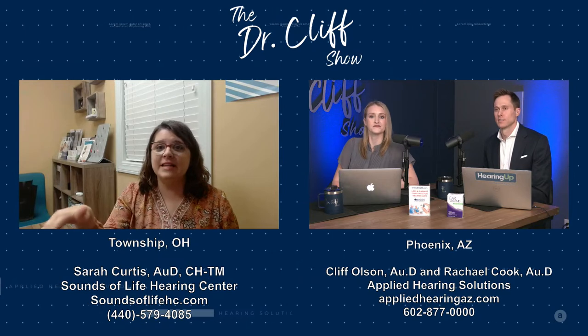But I also counseled him, this is going to be loud and annoying, and you are welcome to curse me under your breath or fully out loud when you go home, but I am not doing my job if I make you comfortable. Rehabilitation means you're uncomfortable on day one. You may be uncomfortable after week 2, but 6 months from now, you're going to call me crying for a loaner if your hearing aid breaks for 5 minutes. So, yep. And that's the goal.